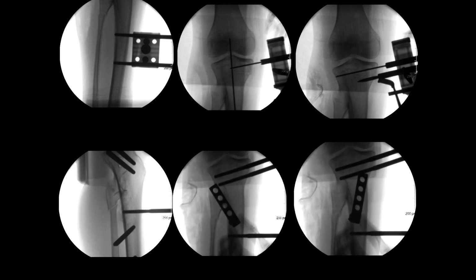You have the perpendicular pins proximally, and you have the perpendicular pins distally. And you have that Rancho cube helping me to dial in. And that's one of the great things I like about coming to these courses. I learn as much as I deliver, and learning that I should be calling this a barrel instead of a dome, I'm going to take that home. Because that's right, it's more of a barrel than a dome.